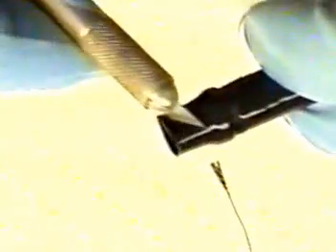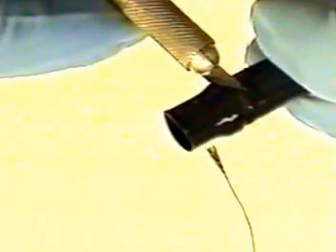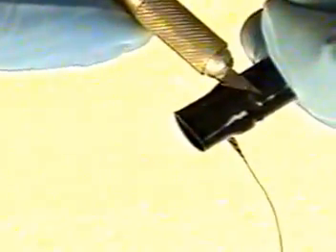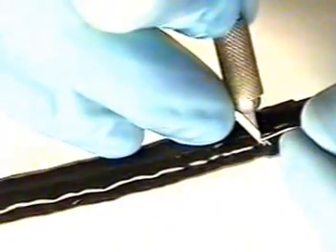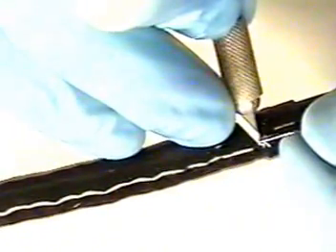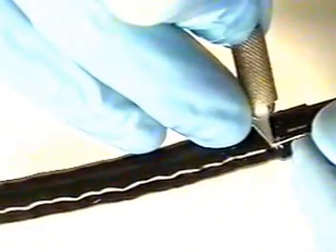Once the Aron Alpha or Crazy Glue has dried, we will carefully cut away the binding thread, first at the top where it meets the distal end. Carefully cut flush up to remove the first thread, and being extremely careful as not to cut into the bending rubber, remove the second end. Also, do the same with the thread at the juncture, by cutting flush up against the binding and not cutting into the bending rubber.